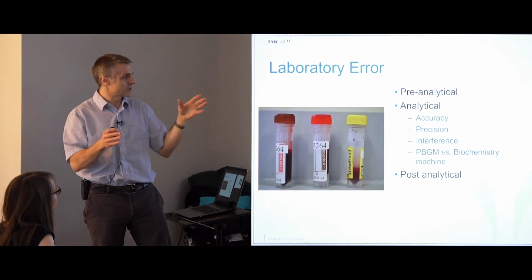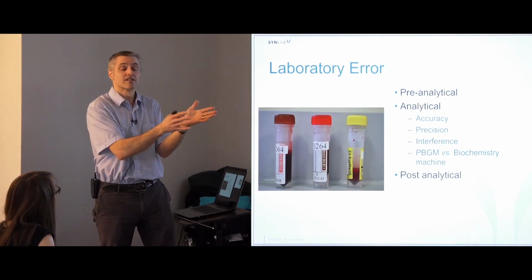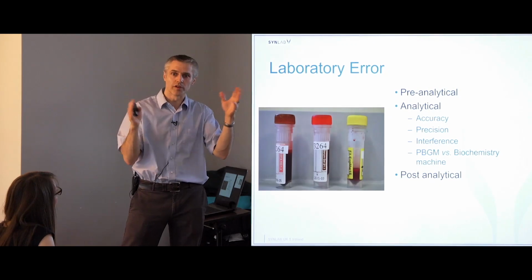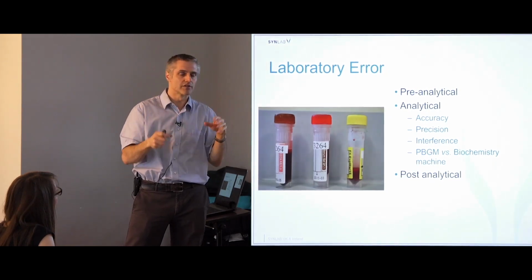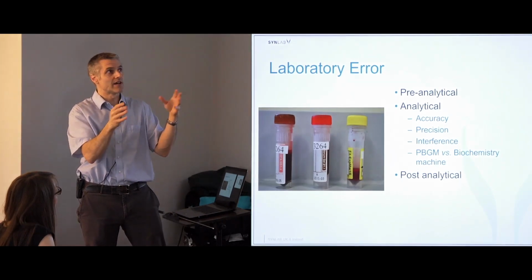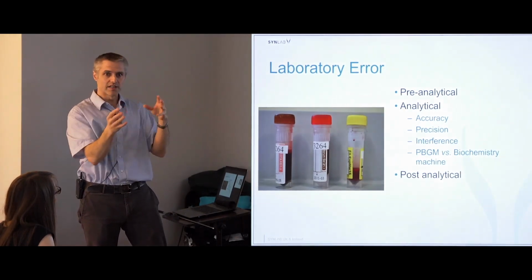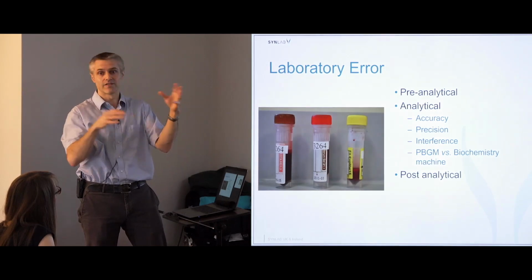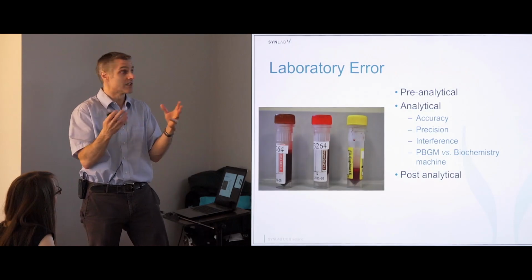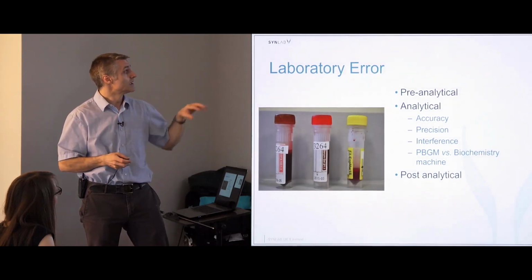The analytical is when you put your blood sample through your hematology analyzer, and then it's kind of a black box. You don't really know what's going on. I'll introduce how they work to a degree, but they inherently have their own limitations. Each one is slightly different, so I can't cover every type today, but I will show you the principles of what they assume and how they work.